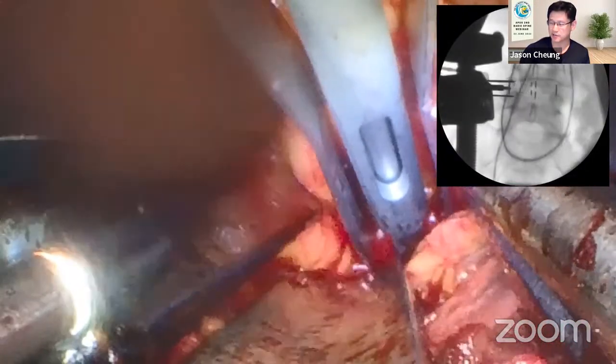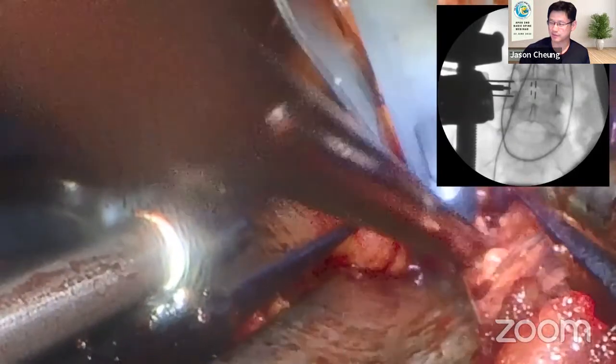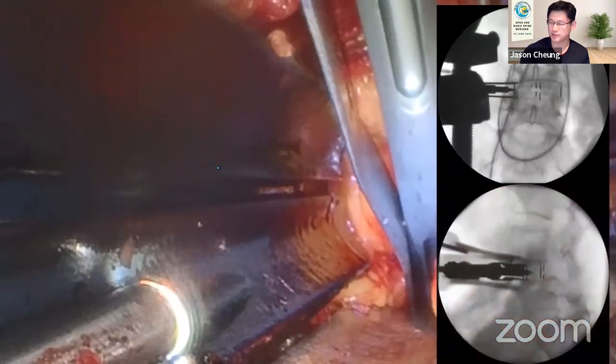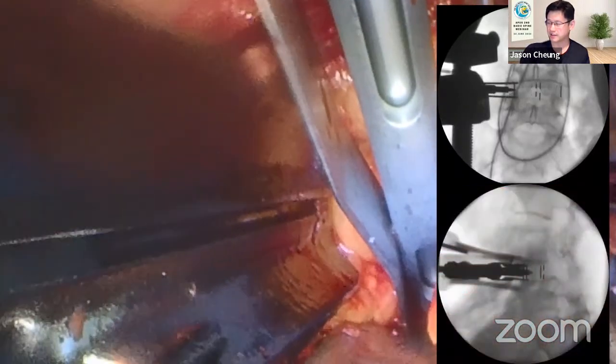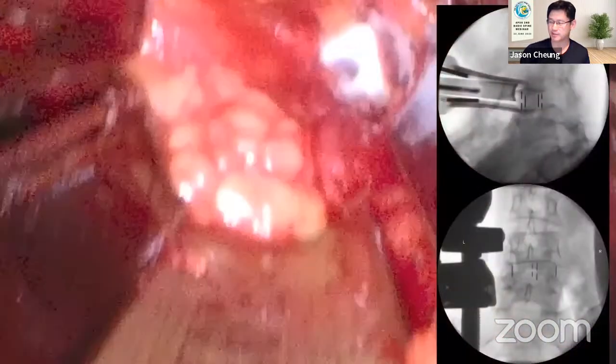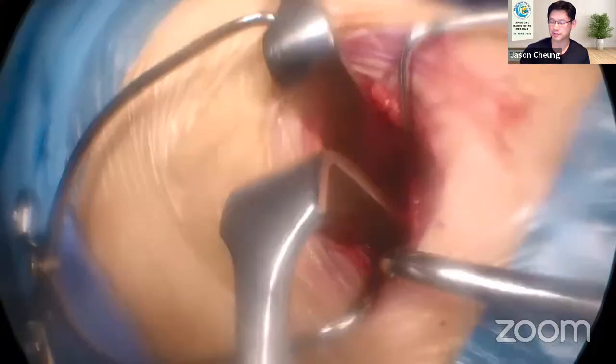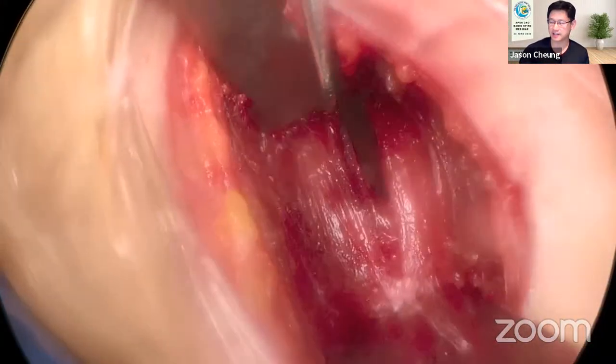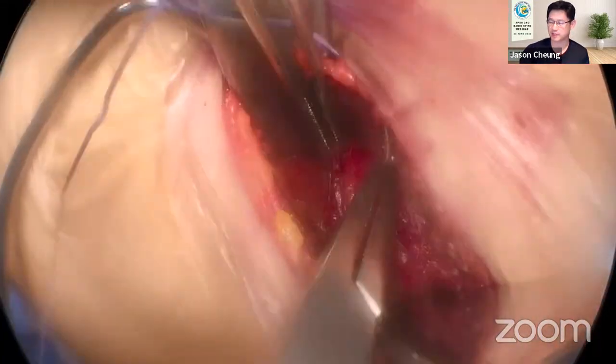Generally speaking, these surgeries have very minimal blood loss and are quite quick if you're able to do them properly. And in indirect decompression procedures, I try to take the cage as far from here as possible so that you get a posterior disc height gain and subsequently decompression.